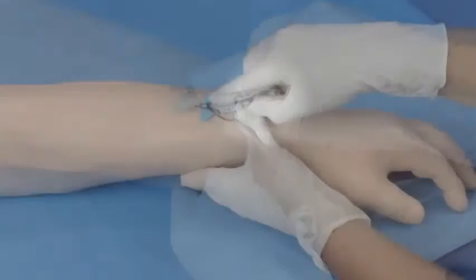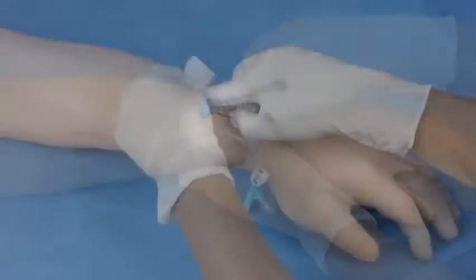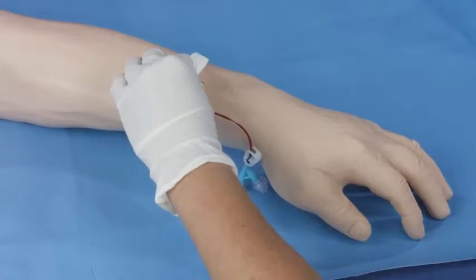Look for continuous blood flow up the extension tube to confirm the catheter tip is still within the vessel. Stabilize the system and shield the needle by pulling back on the white finger grips until the gray push tab component releases from the catheter system.